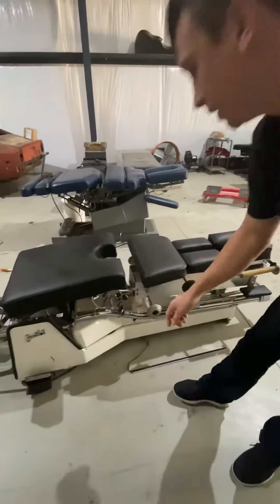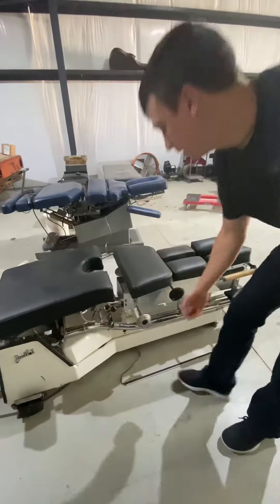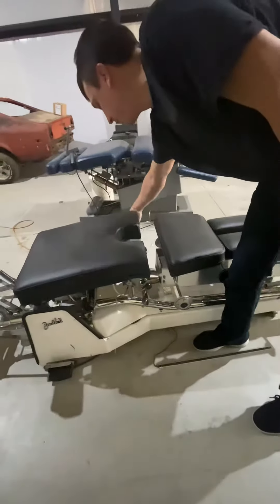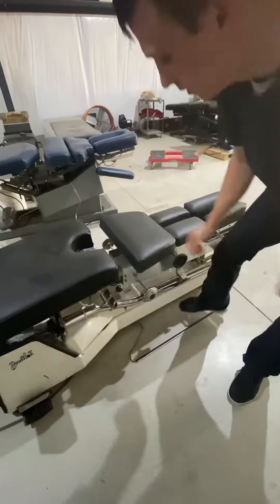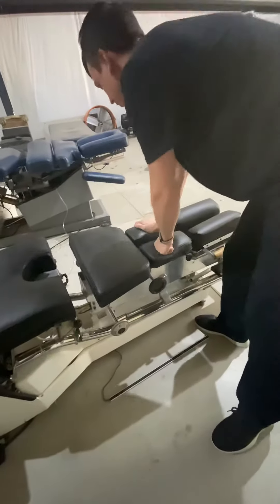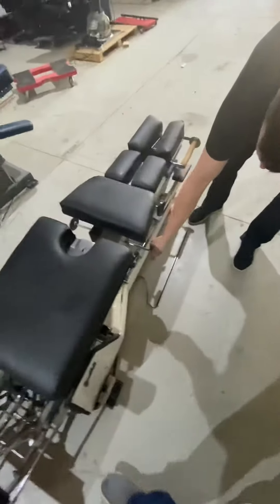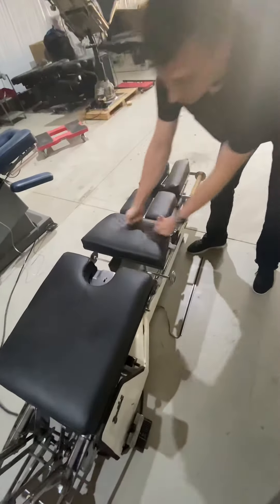It does have the three-directional drop adjustment, which is operational. Here is where you select your drops, and then your tension knob is over here on this side of the table. So there's the lumbar, dorsal, and that also cocked the cervical, which has an on/off switch if you want to disengage the cervical, dorsal, or lumbar. So it's all working.